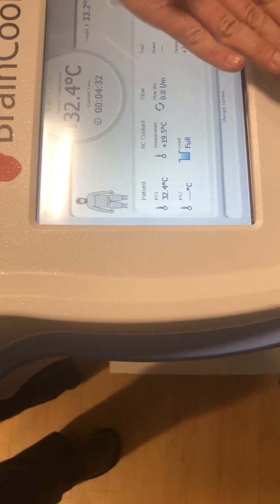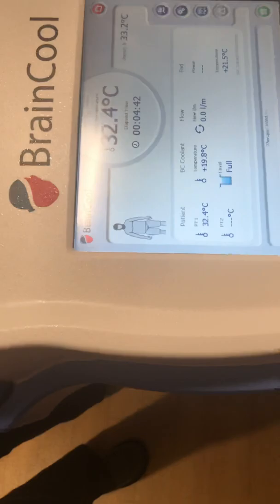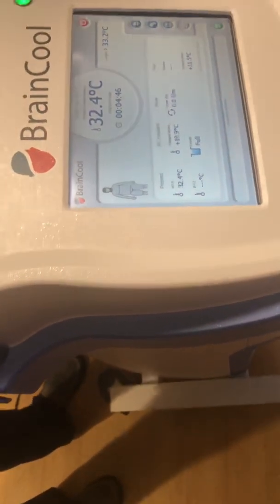So what's this? This is just the return path. You don't need to worry about that. That's taking the temperature from this and the return temperature. You can put two patients on it. PT2 is for another temperature source, so if you wanted to put two here instead of one up there, which we do. I see. They have it in the chart, so to speak.